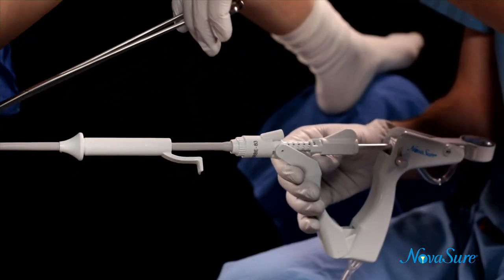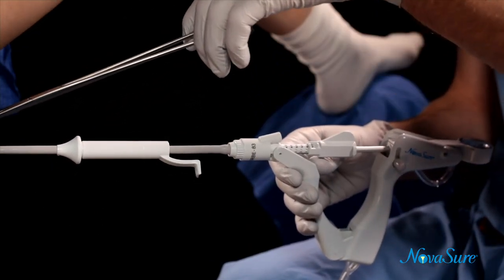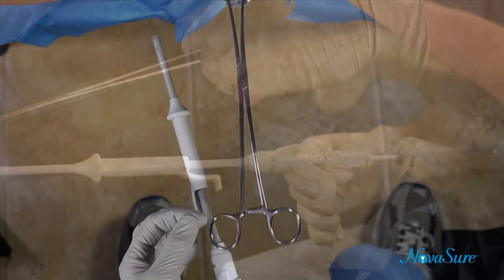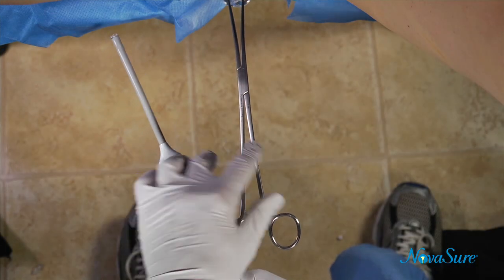Now let's review these steps. After the dilation process is complete, start by maintaining slight traction on the tenaculum to minimize the angle of the uterus. Slide the cervical collar all the way back.